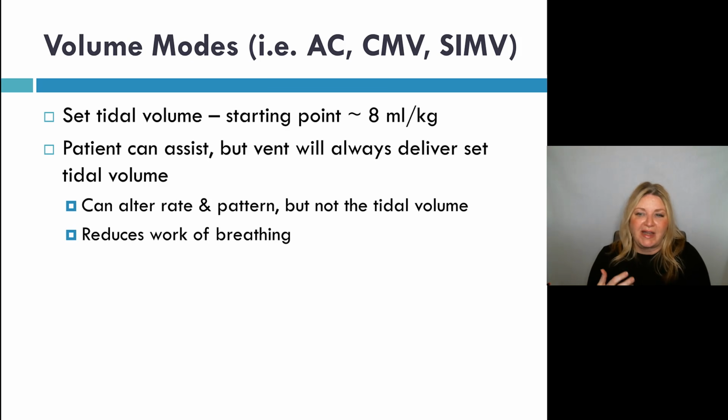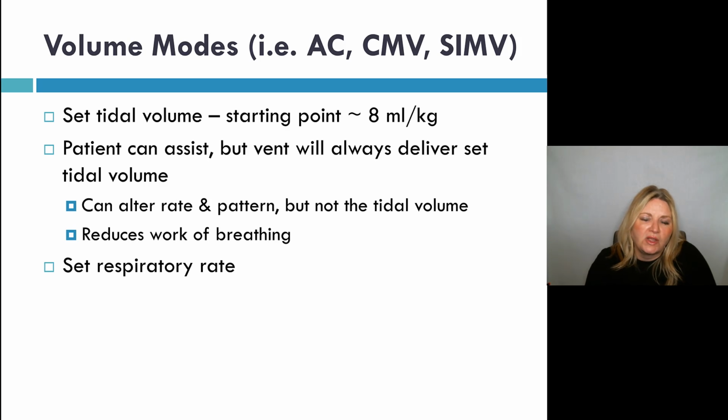So the patient can alter their rate and pattern, but not the volume. So they will always get that volume. And the nice thing about volume modes of ventilation is it can really reduce the workload of breathing. Now you want to set a rate.